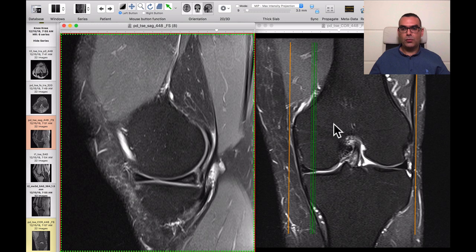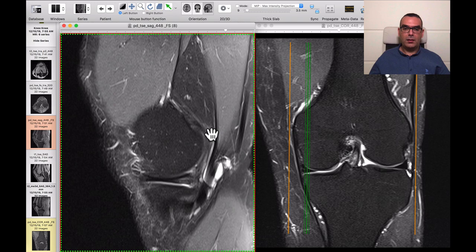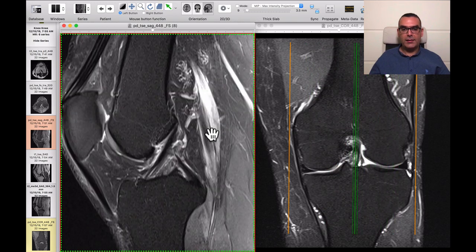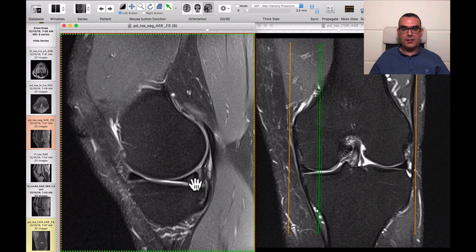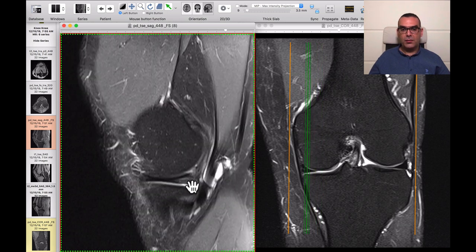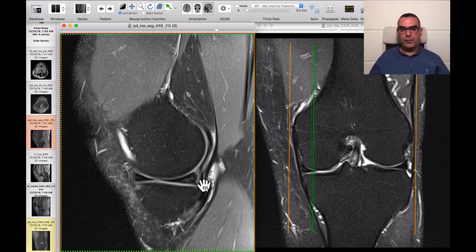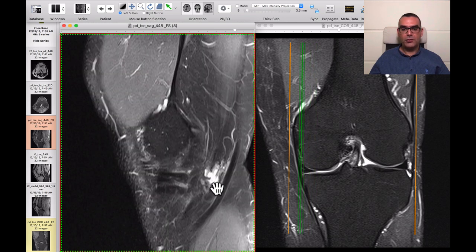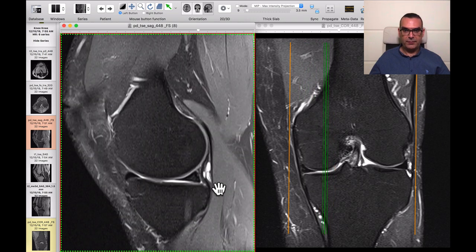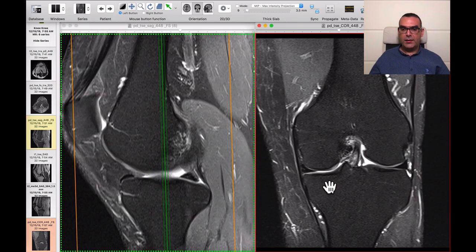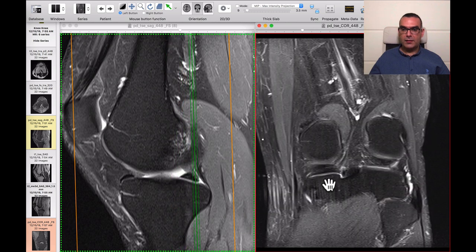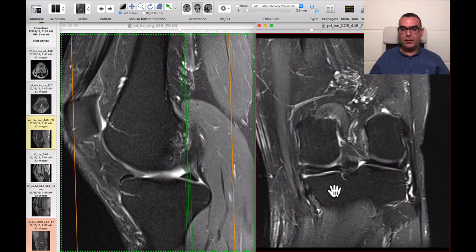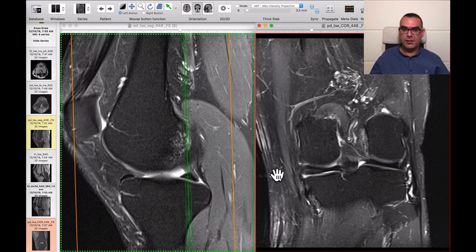This is mature bone — there is no epiphyseal plate. This is a 40-something year old lady. The abnormal signal within the posterior horn of the medial meniscus represents meniscal degeneration — we know it's degeneration because there is no interruption of the superior or inferior articular surfaces. On the coronal scan as well, there is swelling and abnormal hyperintensity within the posterior horn of the medial meniscus not reaching the meniscal surface.